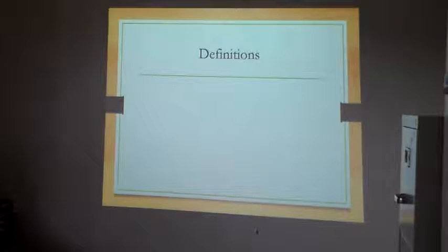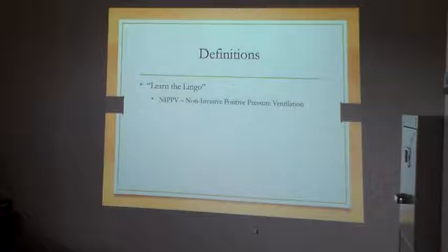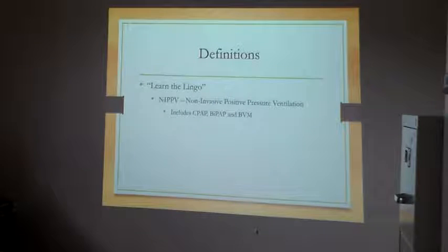Okay, so we're going to talk about some key terms. The first one is the lingo, okay? One of the things we talk about is non-invasive positive pressure ventilation. That includes anything from CPAP, BiPAP, and bag valve mask ventilation. We're going to talk about the difference between each of those, okay?